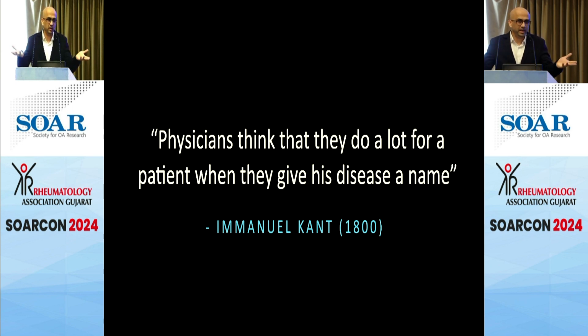It depends on the pain syndrome actually. So if you are treating patients with degenerative low back pain and you talk like this with their MRI reports or MRI scans, you are actually not helping the patient.